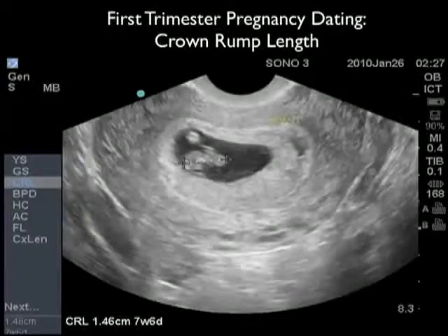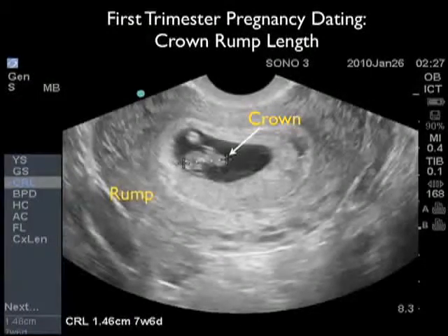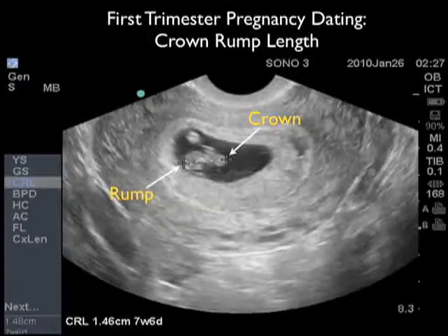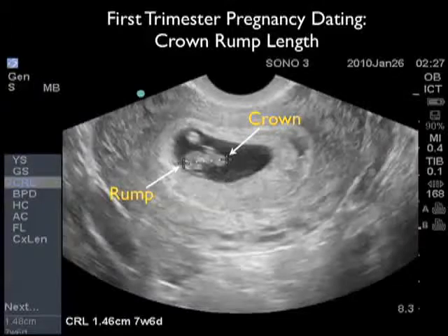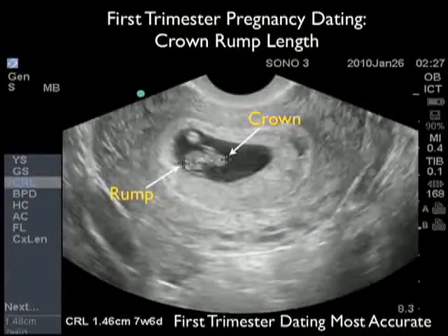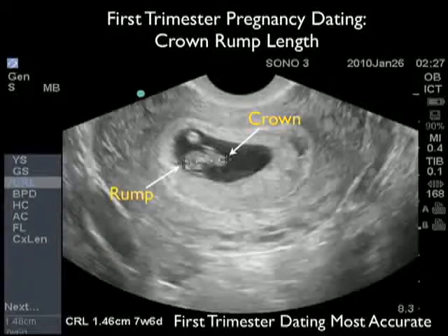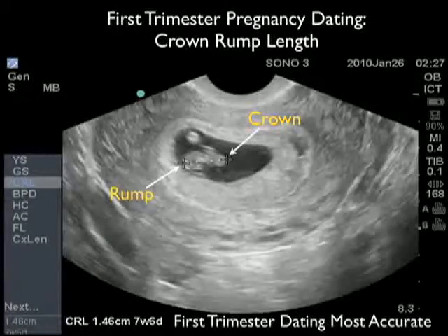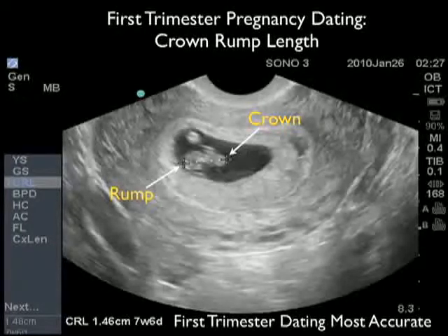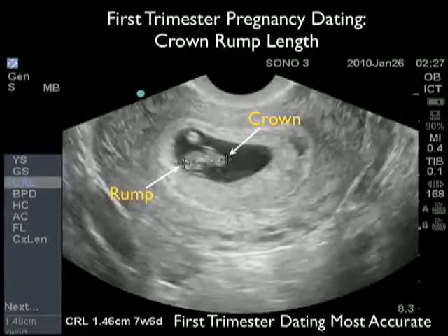This is an image of a first trimester pregnancy, and we're going to evaluate the gestational age by measuring the crown rump length. Here we see the fetal pole stretched across the gestational sac, with the crown located towards the right and the rump towards the left. Placing the calipers from crown to rump, we get a measurement of 1.46 centimeters. By selecting crown rump length in the software, we get a gestational age of 7 weeks and 6 days. It's nice to print this image out and give to your patient for their follow-up visit with their OBGYN.